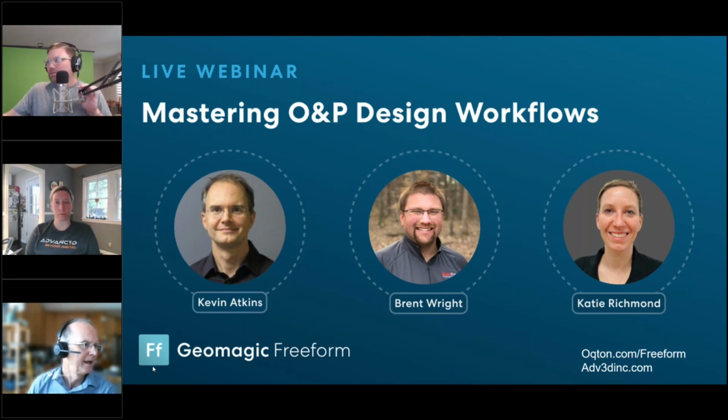Yep. How did you automatically align the standard part with the scan data? I think that's for Katie. I can hit that too. Sure. So we make some assumptions already in the CAD program.